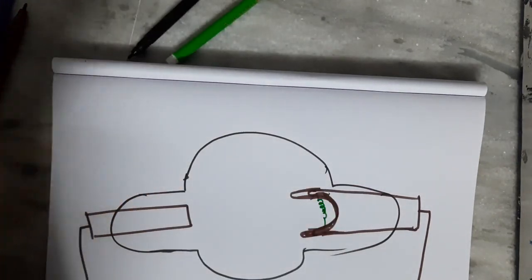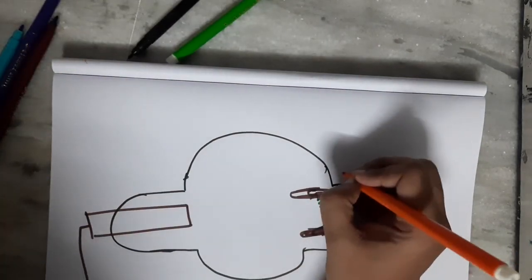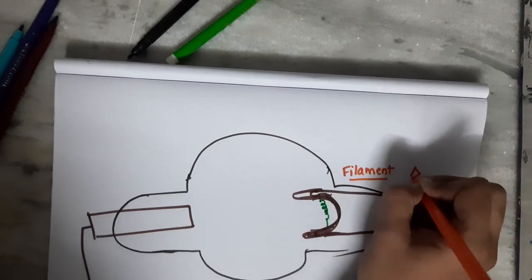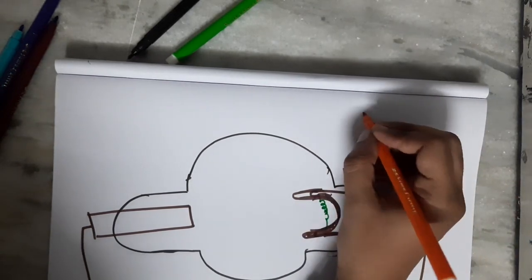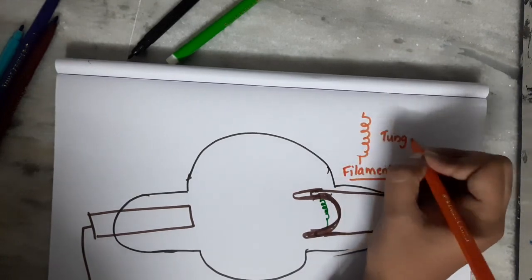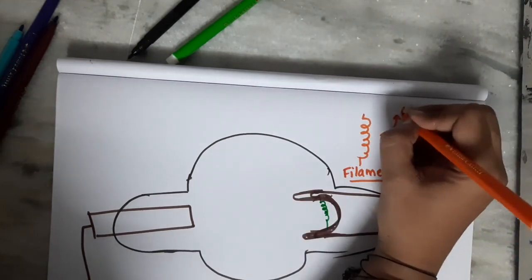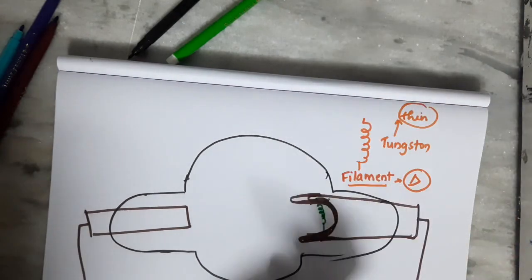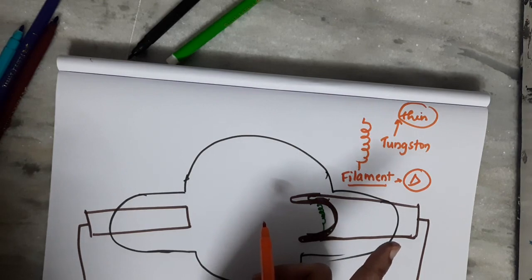Now, what is important is that this filament here, the main important thing in production of X-rays is heating up of the filament. The filament is nothing but tungsten, right? When it gets heated up, slowly the tungsten wire will become thinner and thinner and thinner on heating for longer periods. So that is one important thing.